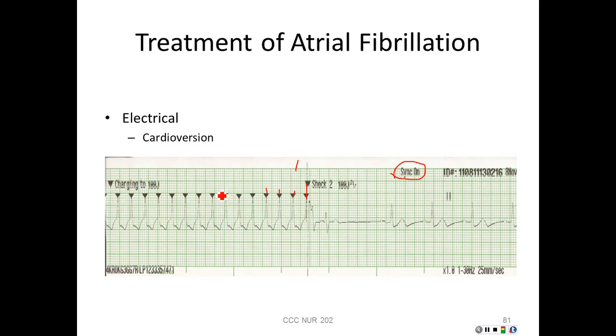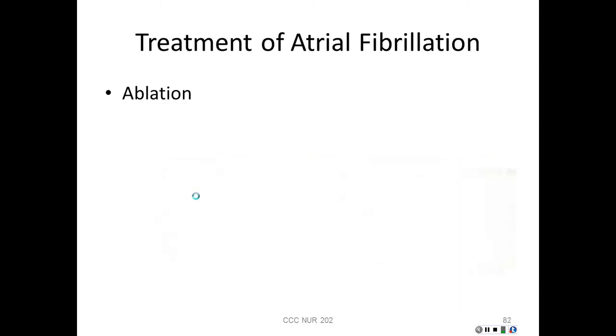Patients are typically sedated because this is painful. They will jump up off the bed when that's done, so it is quite uncomfortable for the patients. Is it successful? Yes. Sometimes you'll shock them, get them back to the floor, and unfortunately they'll go back into the atrial fibrillation. I don't know the percentages of success, I apologize, but you do see these being very successful for our younger patients. Unfortunately, sometimes it's unsuccessful, and we have to look at different types of treatments for these patients.